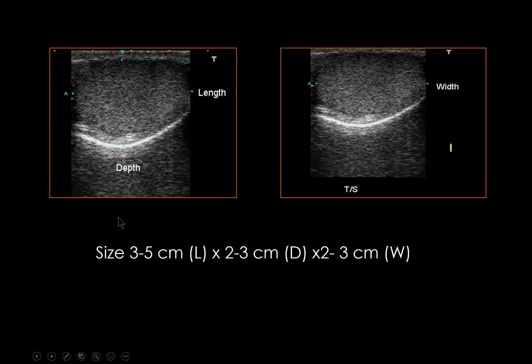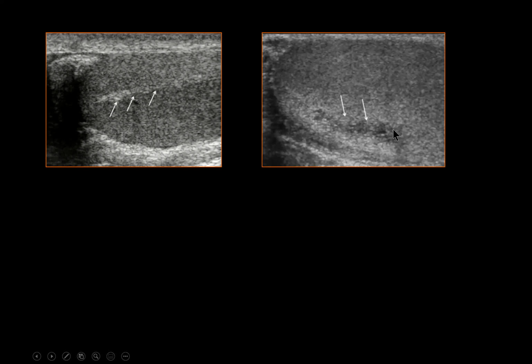We are going more into the anatomy and sonographic appearance. This is the mediastinum. It appears as a highly echogenic linear structure that extends craniocaudally within the testis and parallel to the epididymis. It is draining the seminiferous tubules of the testis into the rete testis. This is the rete testis, which appears as a low reflective or hypoechoic area at the hilum of the testis. It has a finger-like projection into the parenchyma.